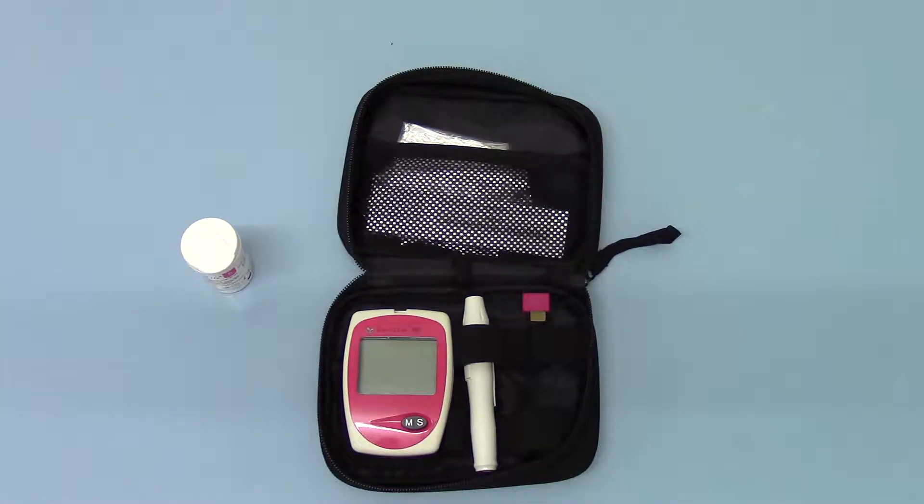Welcome to this product demonstration video where we're going to talk you through setting up and operating an EasyLife haemoglobin meter. We're going to try and give you a few tips to ensure that from the time you purchase these meters, you can follow a procedure to get an accurate haemoglobin reading from your fingers.